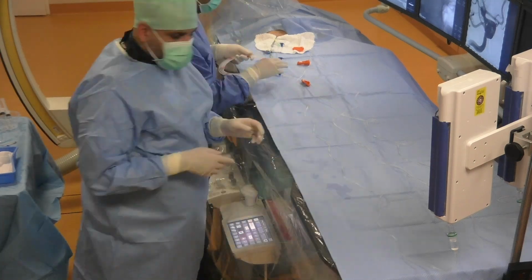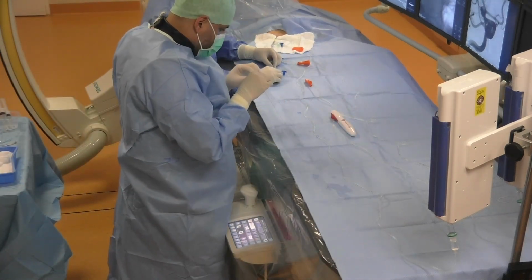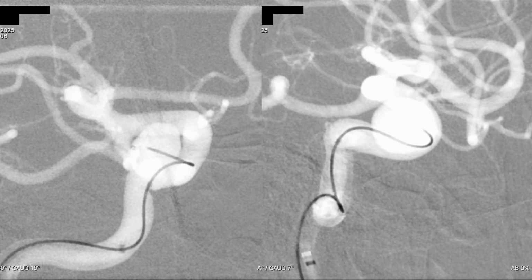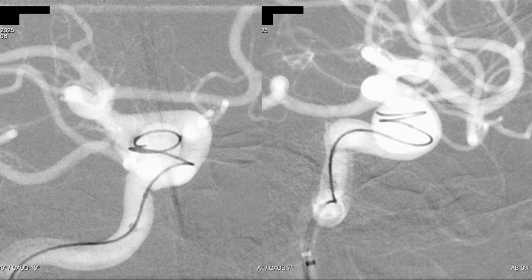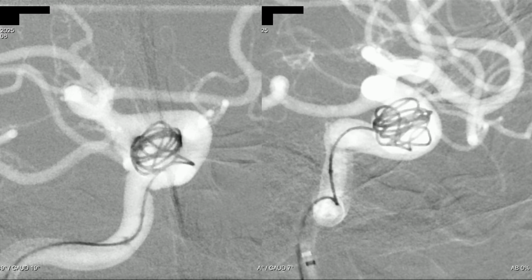We remove the microwire and take our first coil, and as mentioned, it's a volumetric coil PC400 complex standard 10 millimeters by 40 centimeters. As we approach the aneurysm, we pull back the microcatheter a little bit to not injure the wall of the aneurysm and start the coiling. Now we've reached a very good basket. We continue coiling.